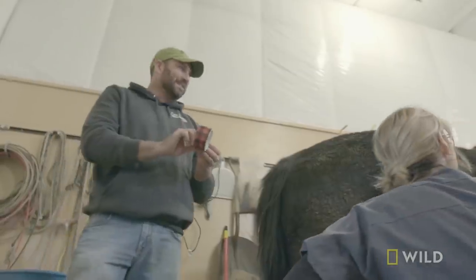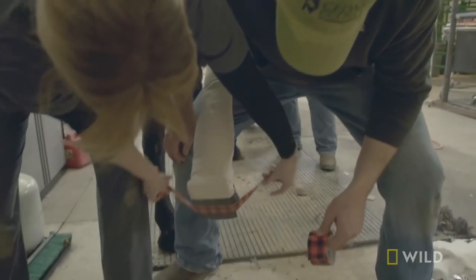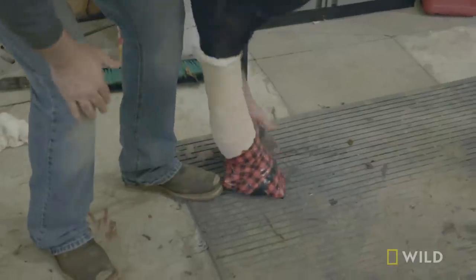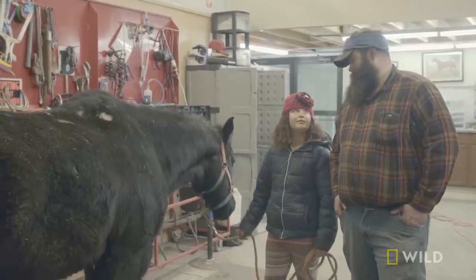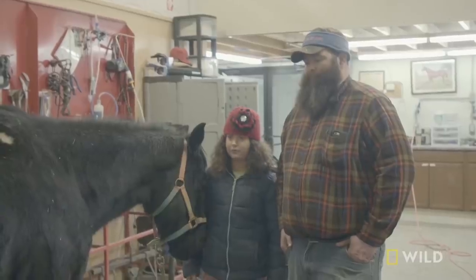You don't mind some plaid duct tape, do you, Travis? It'll match your shirt, Travis — it'll be just fun. This might be a new trend: plaid shoes. That looks pretty waterproof. We've done everything we can. You guys took excellent care of him, but now is where we see how well the inside structures healed and hold.